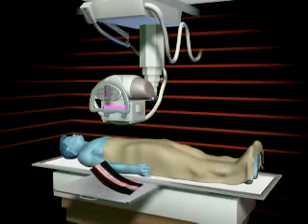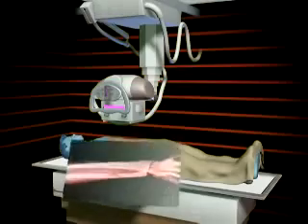The areas where X-ray energy passes through the body become black, while the areas where energy is absorbed by the bones appear white.